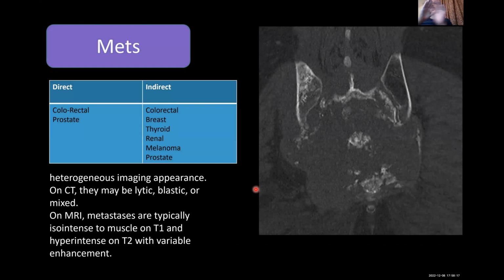Giant cell tumor doesn't show internal calcifications. Pathological fracture can happen in any tumor. If it involves the paramedian upper sacrum with no calcification, we differentiate it from chondrosarcoma.